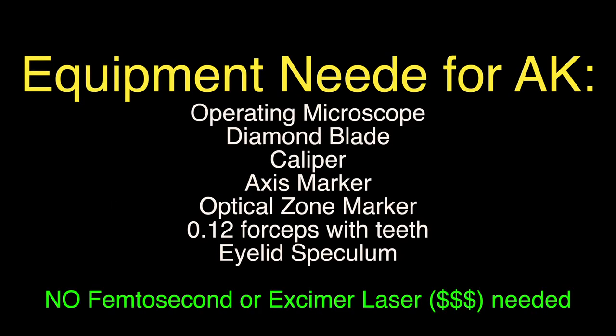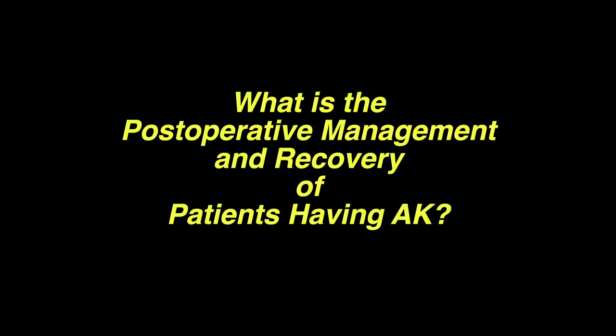The supplies needed are an operating microscope, diamond blade, caliper, axis marker, optical zone marker, 0.12 forceps with teeth, and an eyelid speculum. We don't need a femtosecond or excimer laser, which carry much greater costs for the patient and surgeon. What's the postoperative management and the recovery?